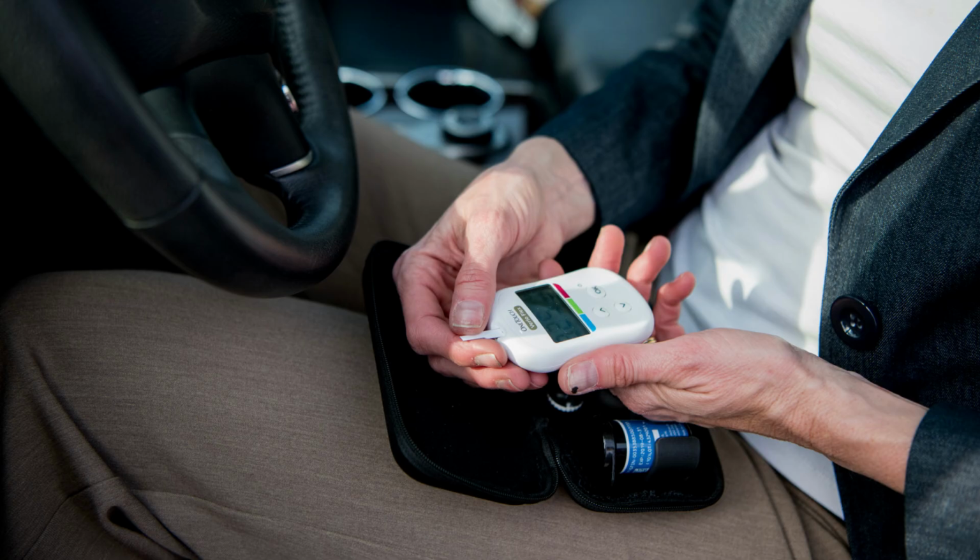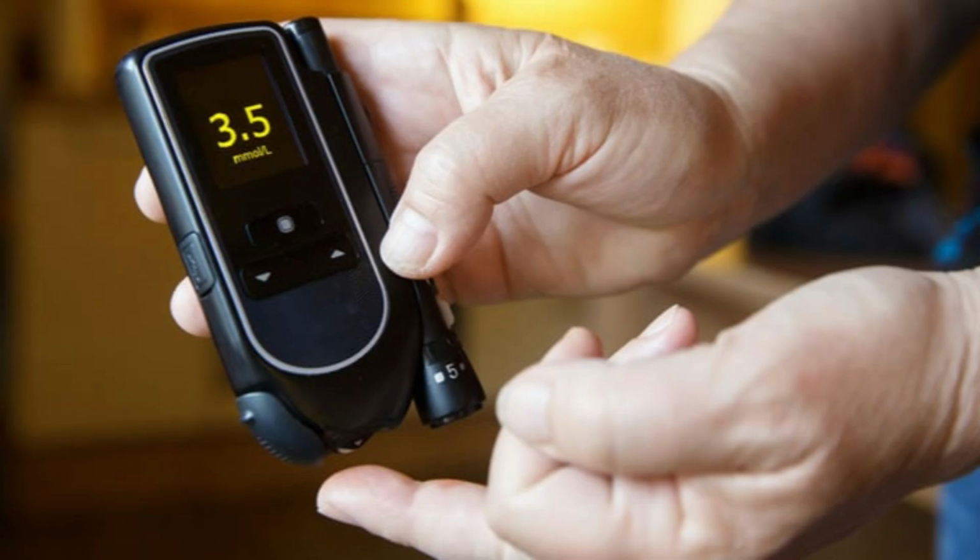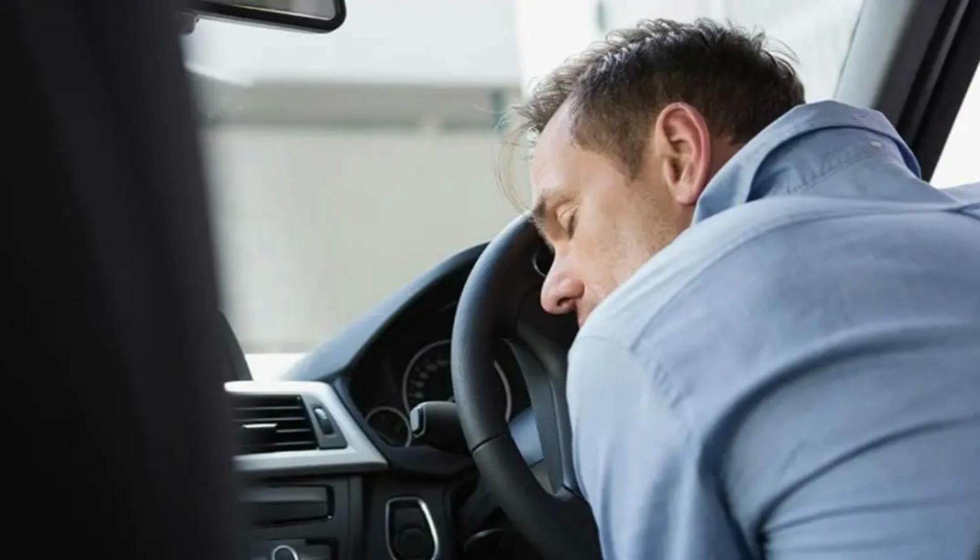For instance, if you work in a safety critical role such as HGV driving, rail, or police work, and you are at risk of having hypos, remember that monitoring is done not to see how high your sugar levels are, but to monitor for low blood sugars, known as hypos. So this is what puts you at risk of sudden incapacitation, especially when driving.